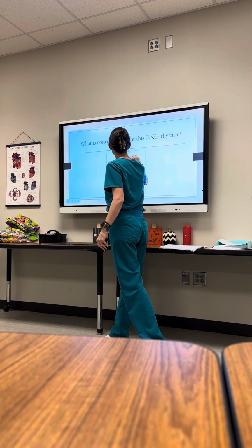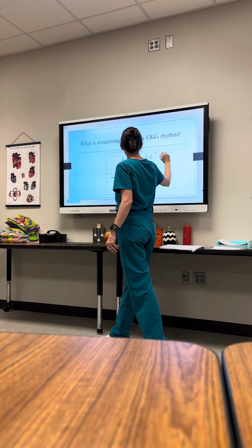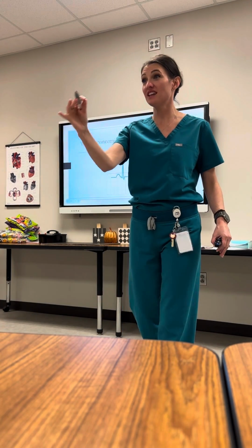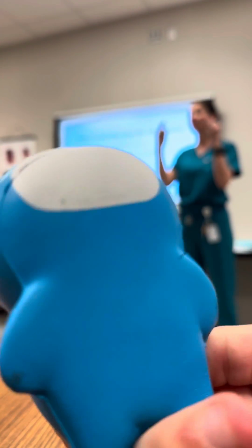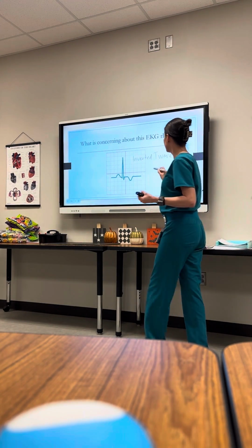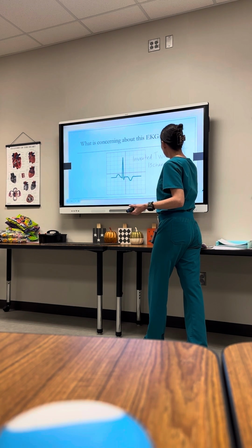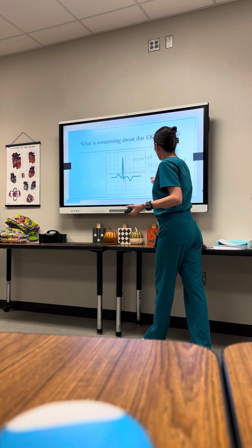This is inverted. Inverted T wave. That's what I said. You were the only one that fully said inverted T wave. Some of y'all were just saying it in other words, but you need to lock in inverted T wave. It's indicative of, remember we talked about this, an ischemic event, MI, or previous cardiac injury.